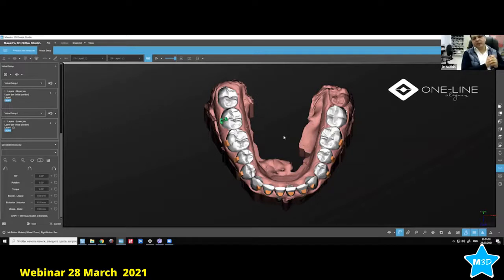So we use pressure forming, BioStar, and we have one BioStar and one Ministar in the lab. We also have as a backup the Chinese vacuum one, in case one day something happens and the compressor is not working. The vacuum one is good, it doesn't need a compressor, but the BioStar and the Ministar we use with the compressor. So that is just a backup which is there in case one day something happens and we need to work with something else.